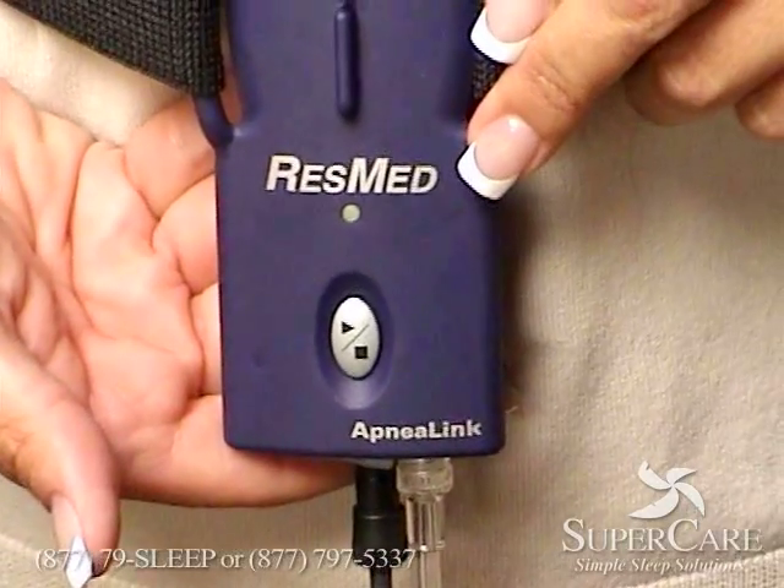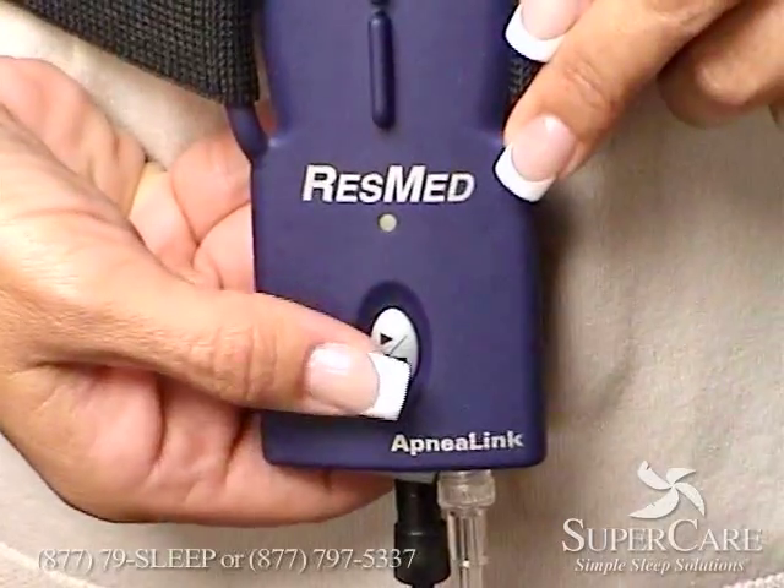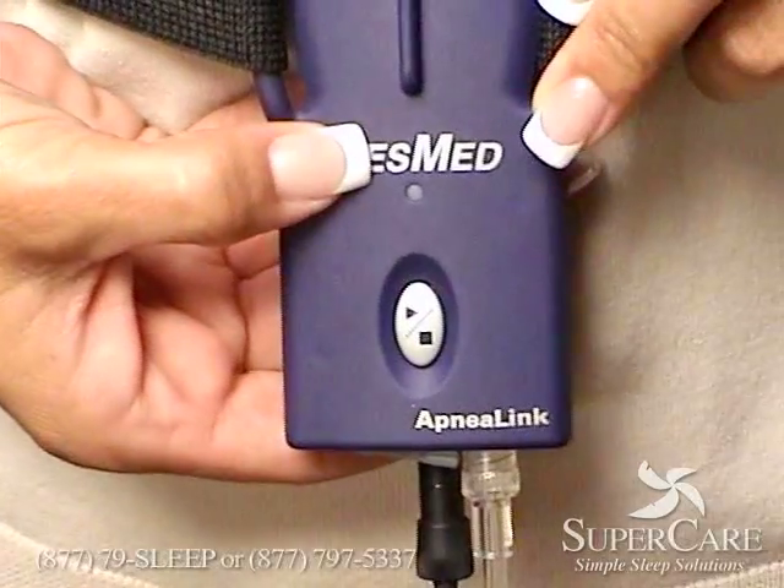In the morning when you're ready to turn it off, you're going to press the same silver button three times in a row — one, two, three — and the little light will turn off.